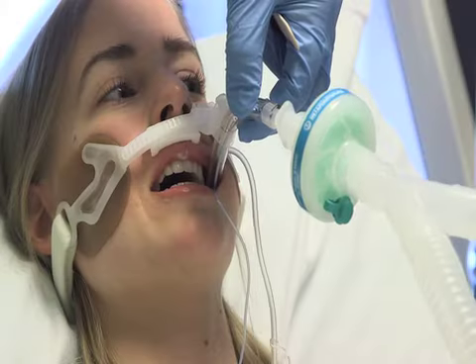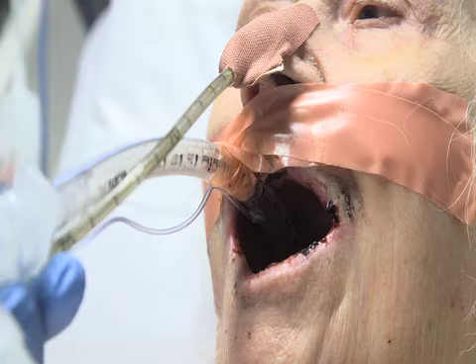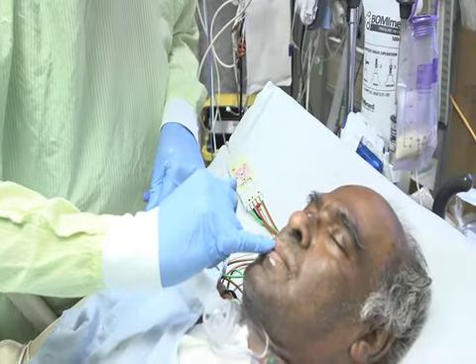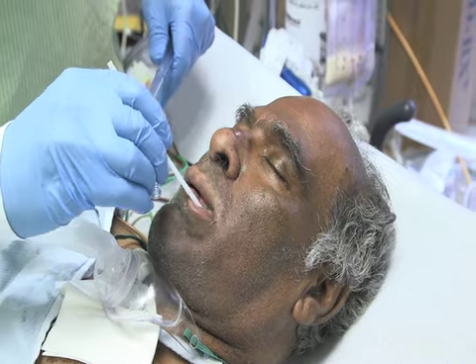Use of a water-soluble moisturizer every 2 hours is important for the maintenance of healthy lips, tongue, and gums. Dryness and cracking of the lips, tongue, and gums provide regions for bacterial proliferation. A water-soluble moisturizer allows tissue absorption and added hydration. Moisten a toothette with moisturizer or sterile water. Apply the moistened toothette to the lips, tongue, and mucosa.